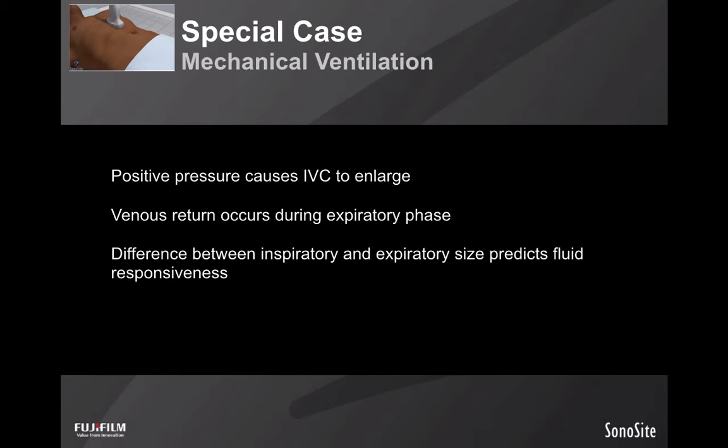Therefore, if I am able to appreciate a change in the IVC size in an intubated patient, I proceed with a fluid challenge. If you see a plethoric IVC that is large and shows no change, volume expansion is unlikely to benefit your patient. And remember to always perform serial examinations to assess responsiveness.